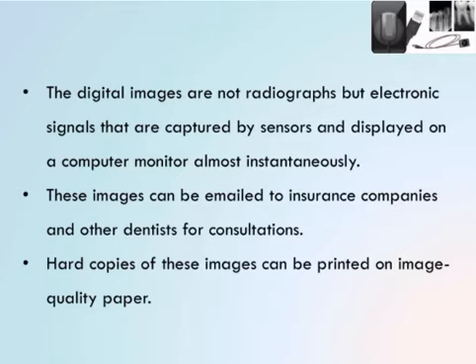If you are using film-based radiographs, then what are you going to do? You're going to develop the radiograph, then fix it, dry it, and finally you can use that for the dentist. So only one person views it. For the insurance company, you have to either use a duplicate film or do a double radiographic exposure if required. With the help of digital imaging, we need not do the double exposures.